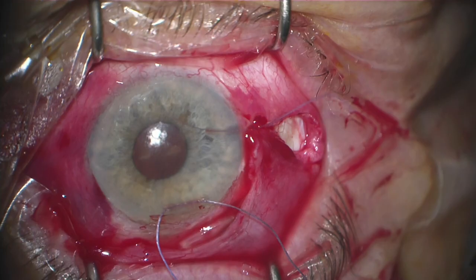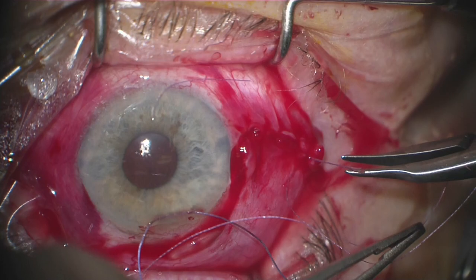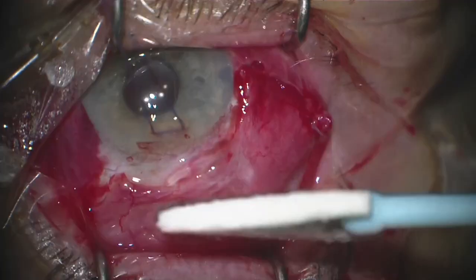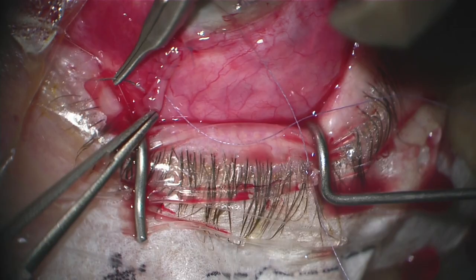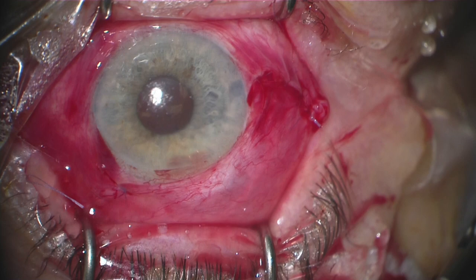The final step of the case will be to close the conjunctiva. I will often loosen the speculum, bring the eye back into primary position, and try to advance the conjunctiva up to the limbus. Once the conjunctiva is in place, we'll close each of the relaxing incisions with a running Vicryl suture. I typically will try to get deep bites for the first two or three bites so that the tissue is less likely to cheese-wire, then take more superficial bites as we get further posterior from the limbus.